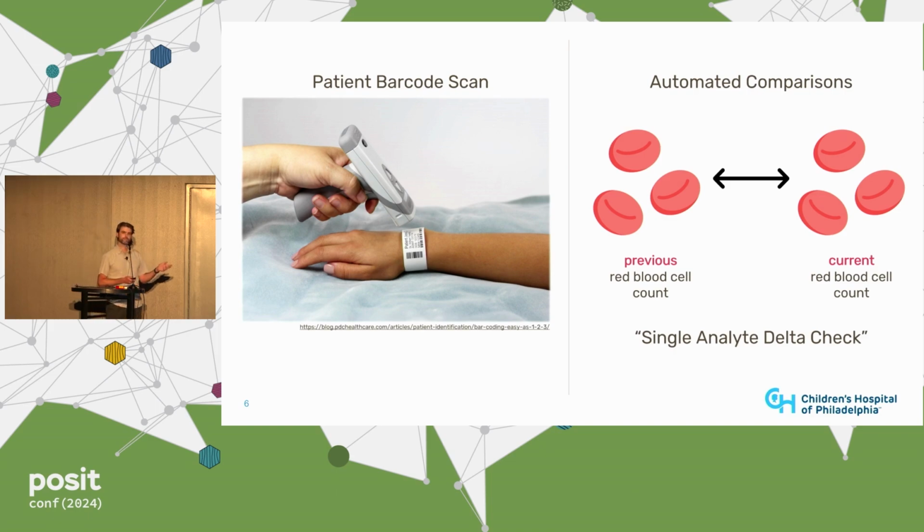And we were actually really interested in this automated approach because in the tubes of blood and in everybody's blood right now, there's more than just red blood cells, right?